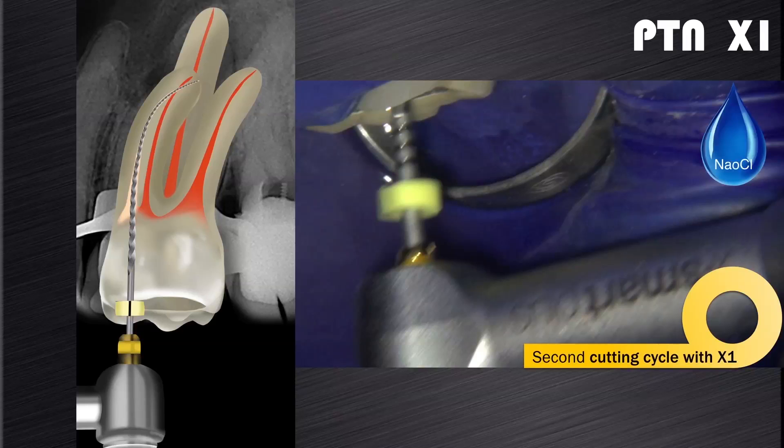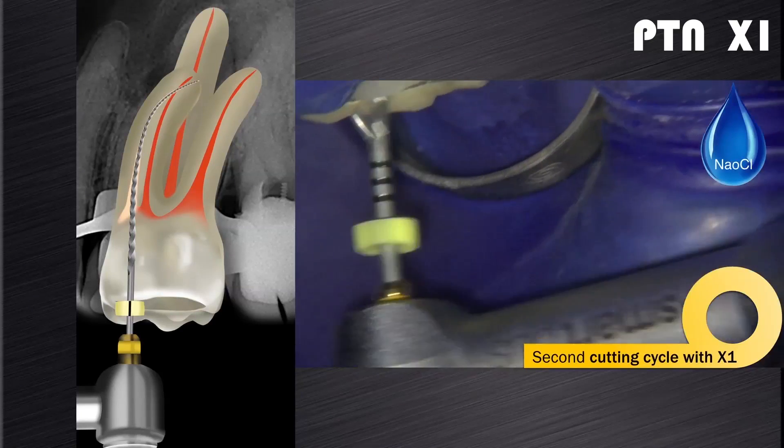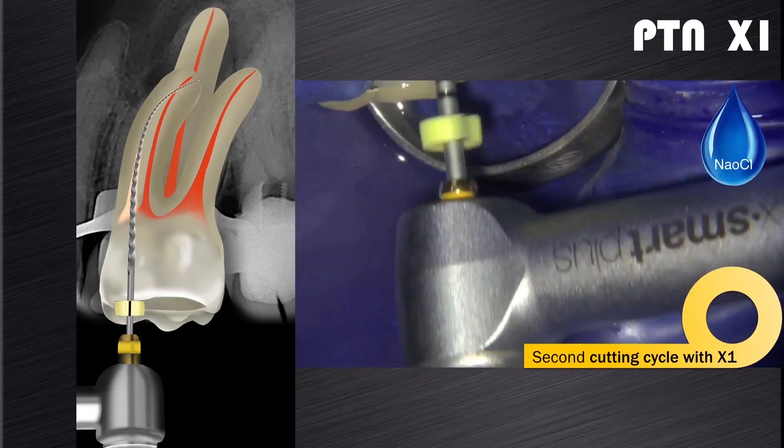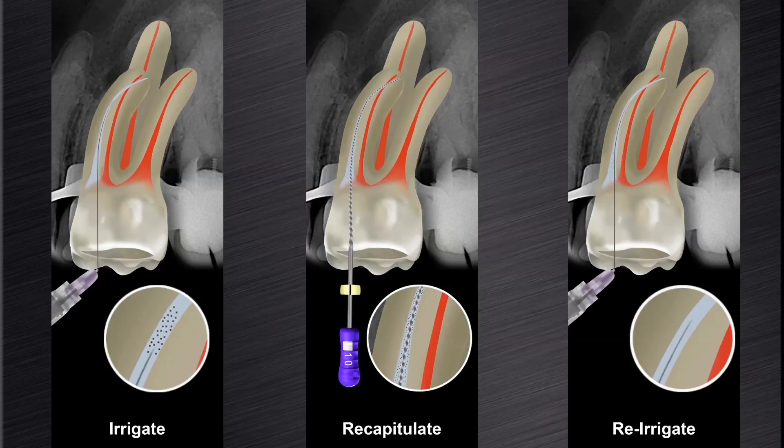In most cases the X1 will reach working length during the second cutting cycle. The file is allowed to carefully work its way down to working length in each canal using the same technique as described before. When the file feels loose at working length it is removed from the canal. This is again followed by a cycle of irrigation, recapitulation, and re-irrigation.